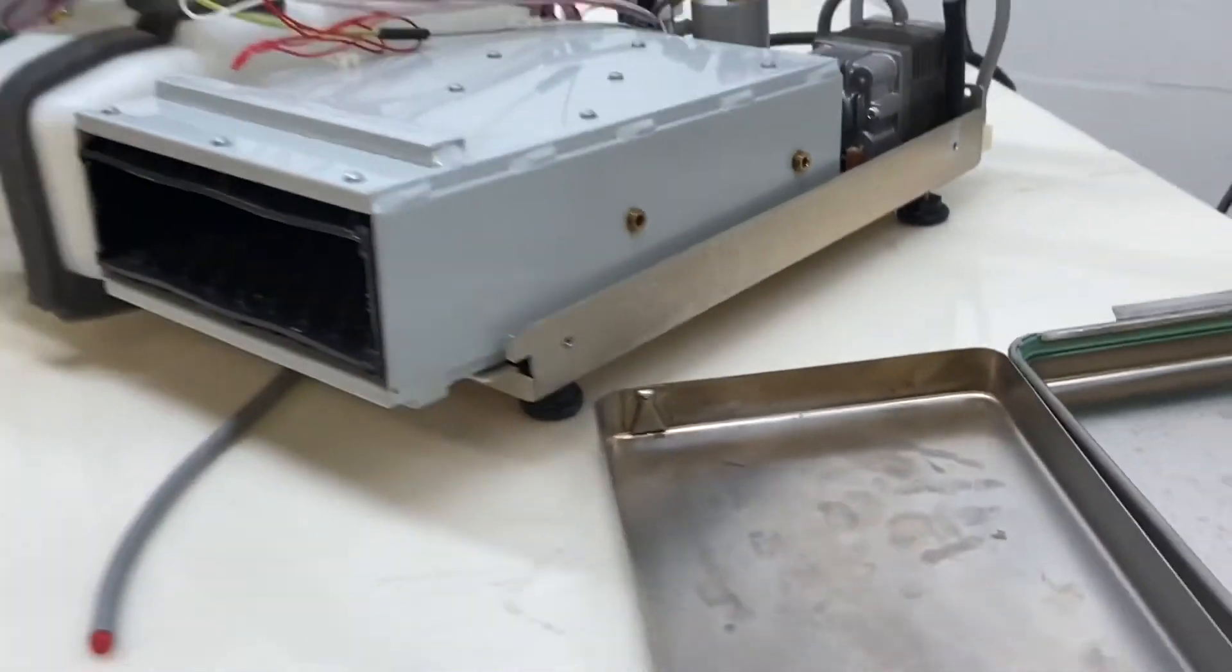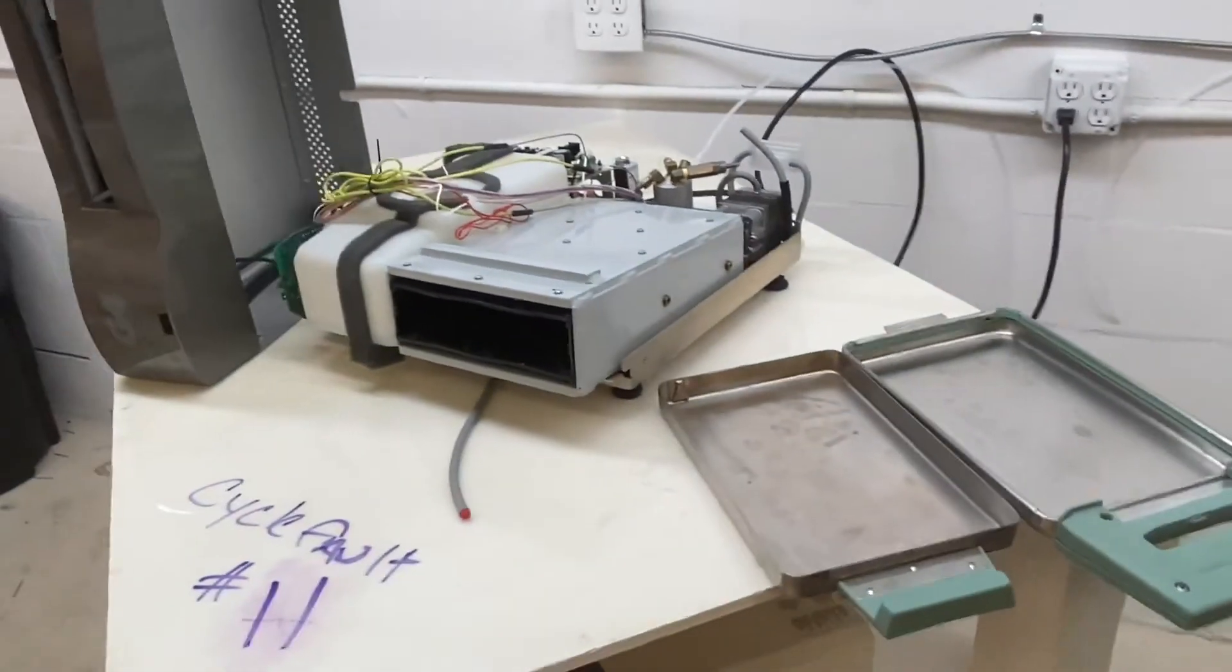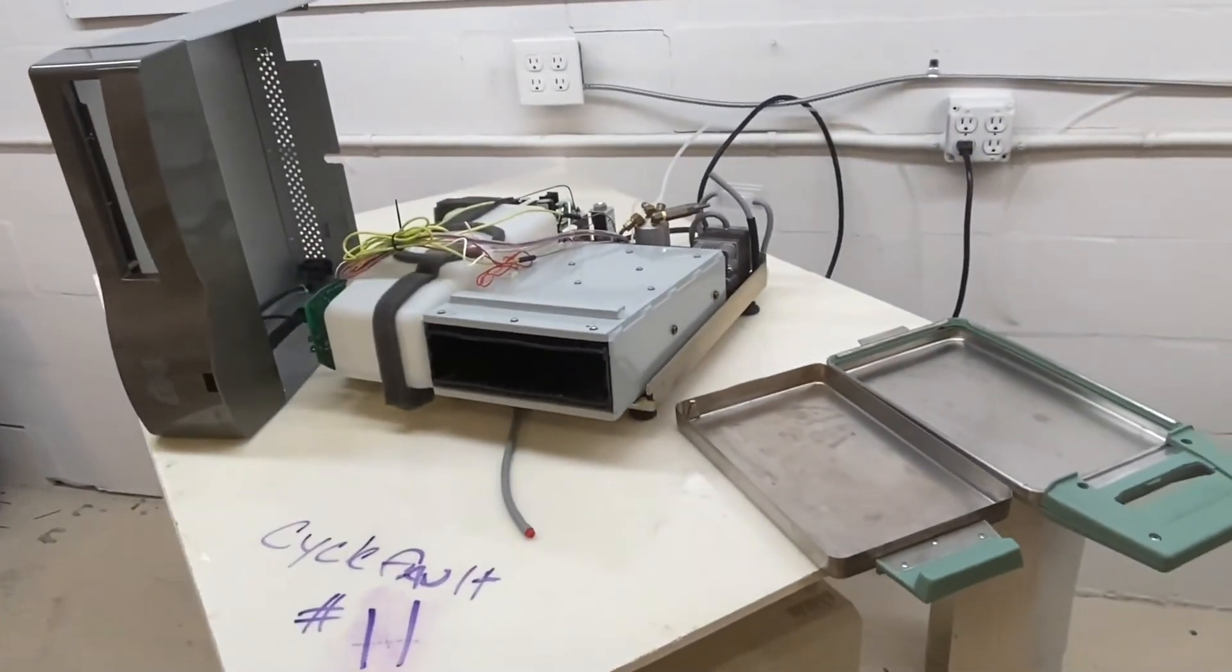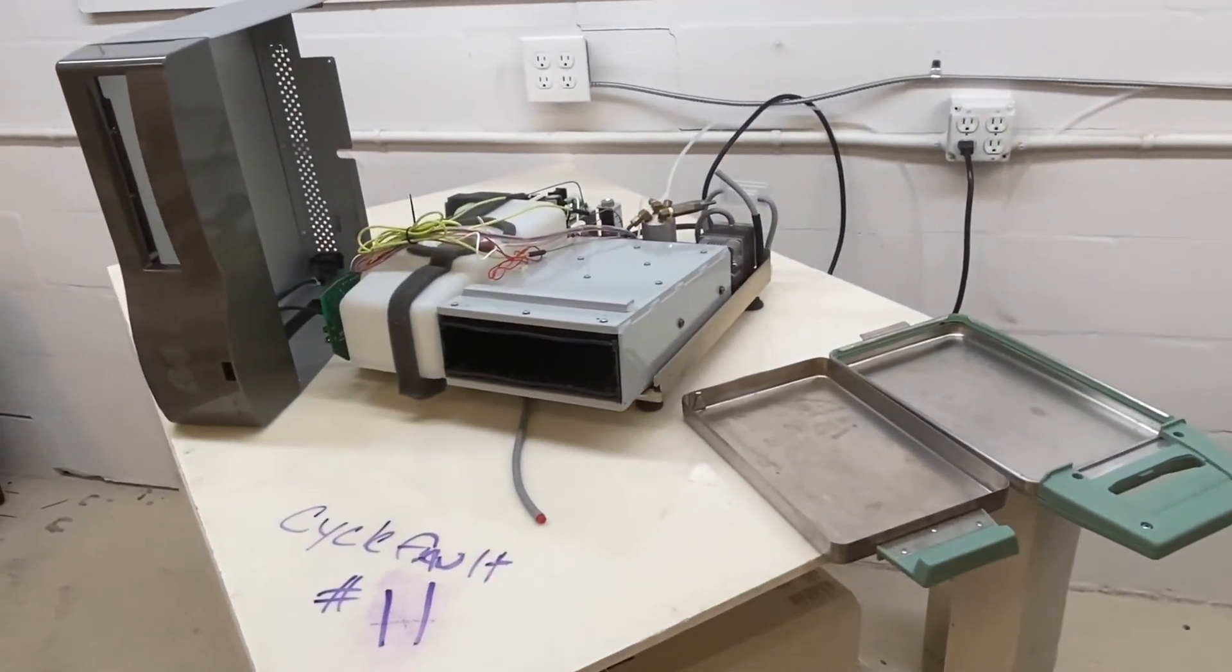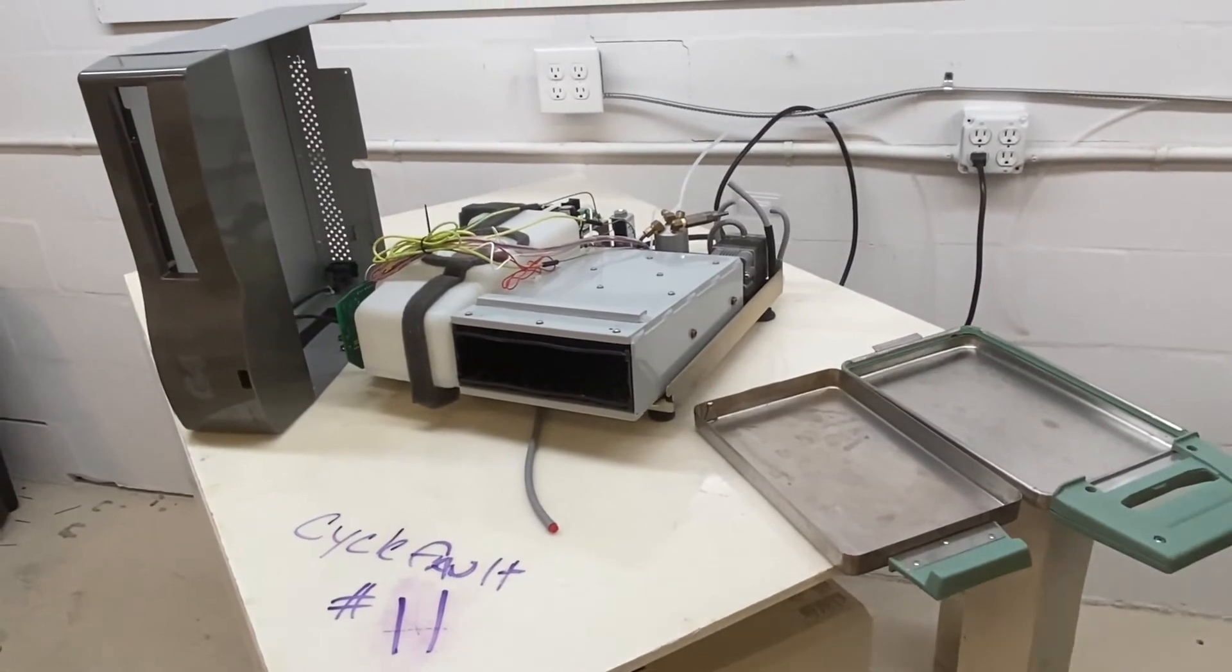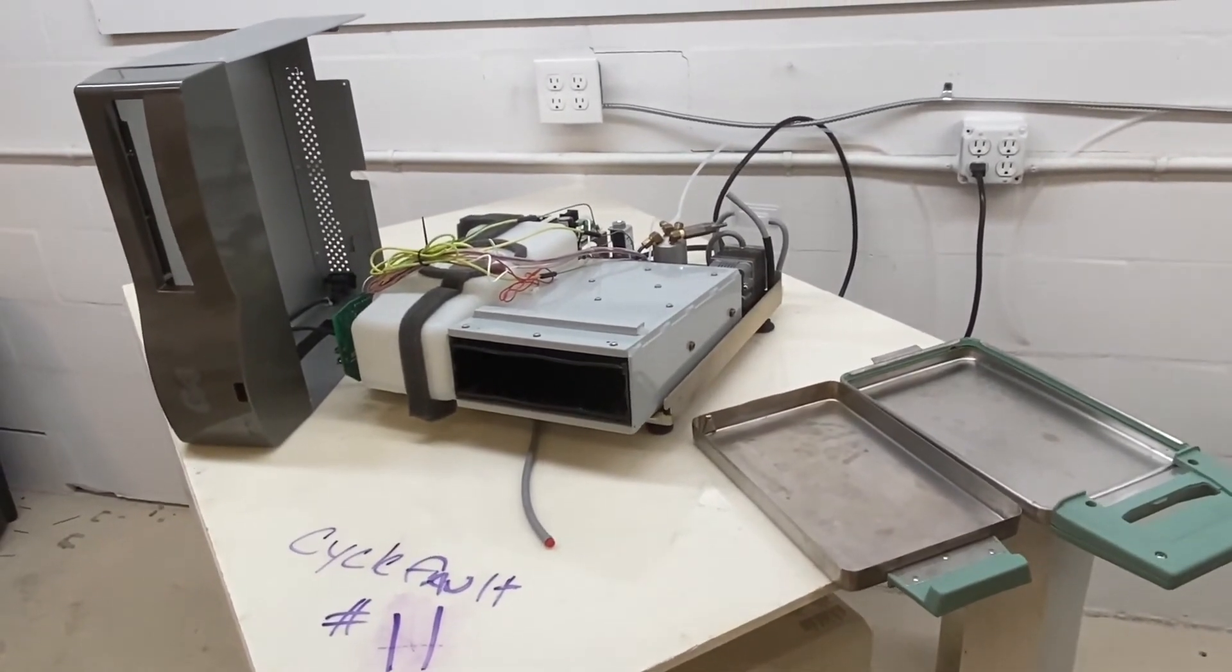Give us a call, 704-966-1650. Cycle fault number 11. Over and out.